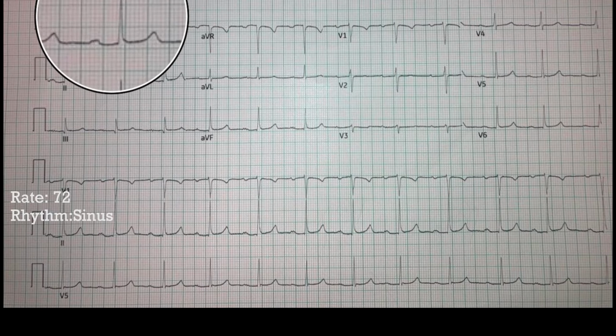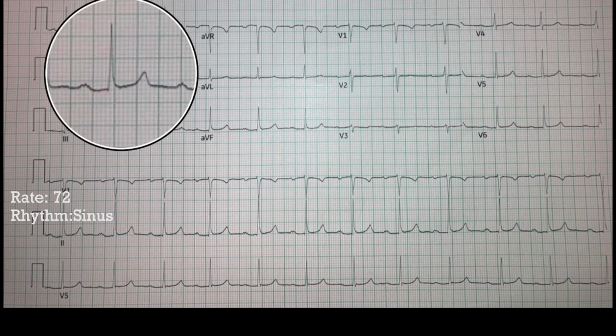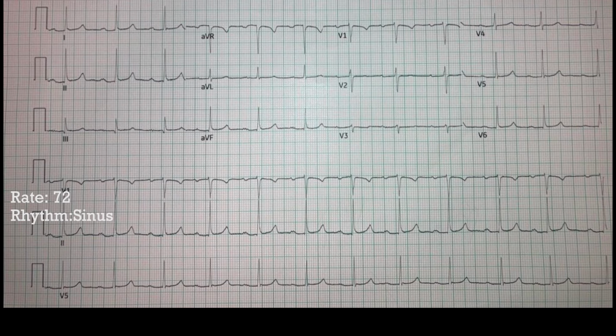If we look at lead 2, we find it's also up, and that could give us a little more of a clue if it was not entirely clear. But we're up in 1, up in 2, up in AVF, so this will be a normal axis. Just looking at it, let's say this is probably 45 degrees, somewhere around there. That's just a guess, and the number doesn't really matter that much. All right, so normal rate, sinus rhythm, normal axis.